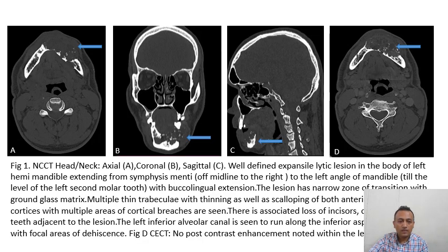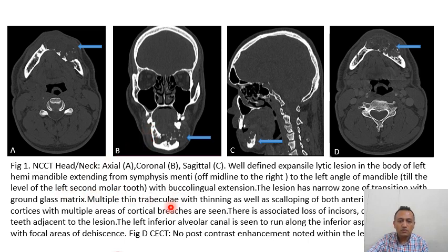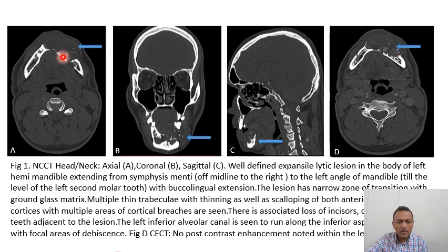On NCCT head and neck — axial, coronal and sagittal views — there is an expansile lytic lesion in the body of the left hemimandible extending from the symphysis menti to the left angle of the mandible at the level of the second molar tooth with buccolingual extension. The lesion has a narrow zone of transition with ground-glass matrix; multiple thin trabeculae with scalloping of both anterior and posterior cortices with multiple areas of cortical breaches. Loss of incisors, canine and premolar teeth adjacent to the lesion is noted. No post-contrast enhancement is seen on CECT.